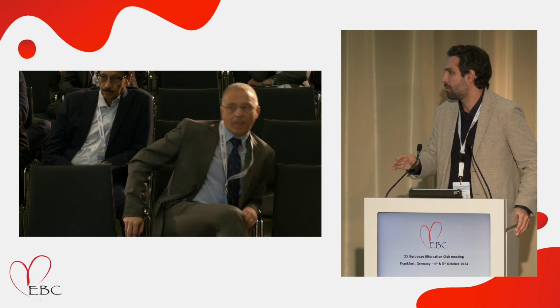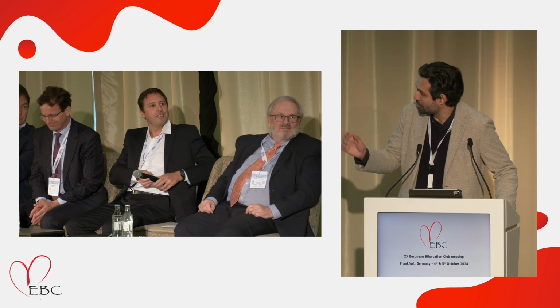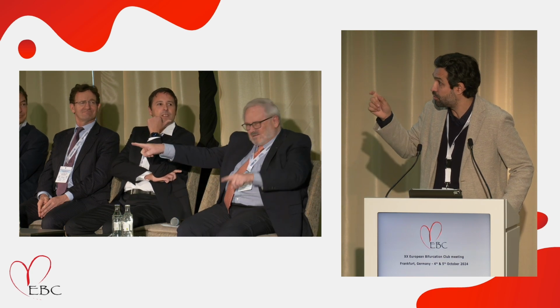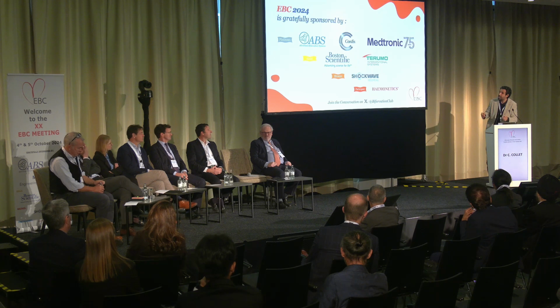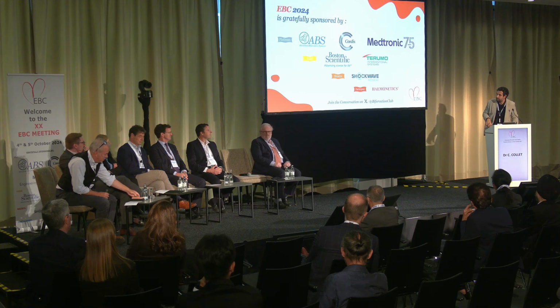Okay, there are 4 potential questions. Short question, short answer. Go. My question is, what is the role of intravascular imaging and physiology when you have this technology available? And when you have it, how many times are you using this technology? Short answer. I think this facilitates the interpretation of intravascular imaging. When you have a 3D plaque, it's very easy to know where you're looking at the cross-sectional plane. So that's one option. But to give you the controversial answer, for the pre-PCI part, CT solves almost all the questions that you would answer with intravascular imaging, pre-PCI.